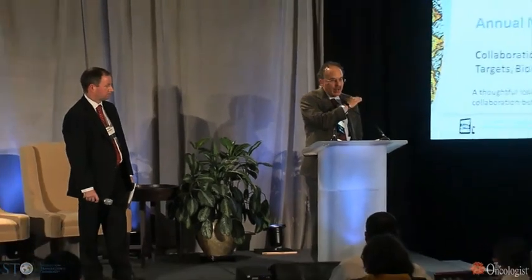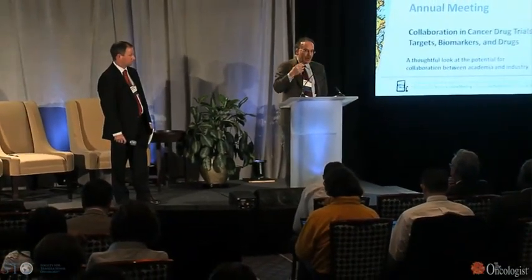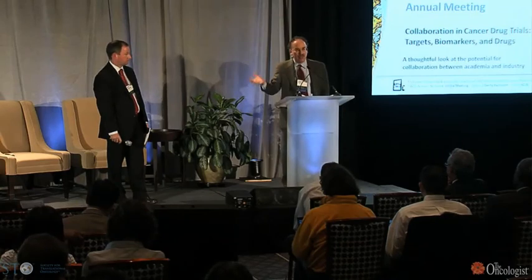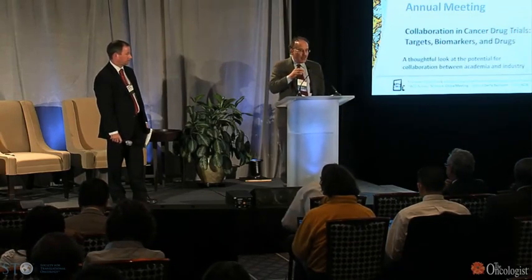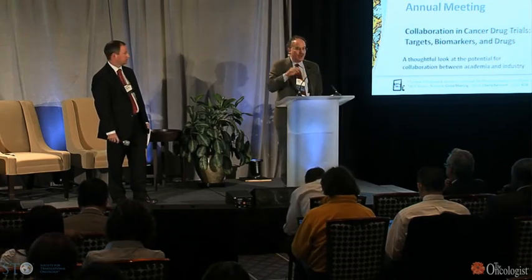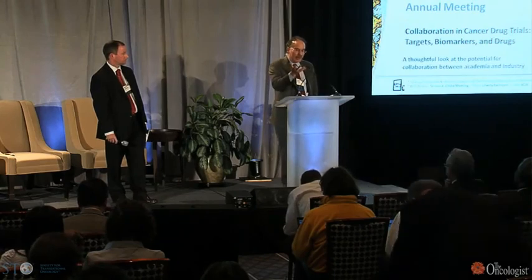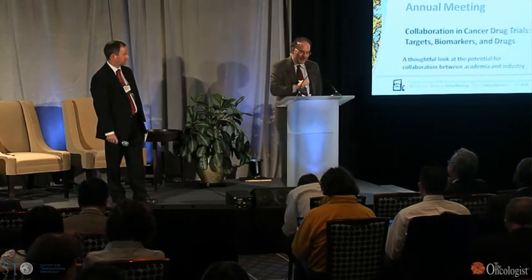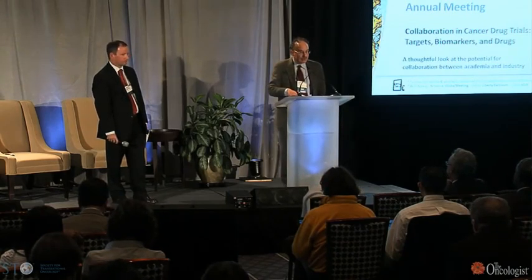I think that philosophically, the current technology, with the Veridex platform, is not that sensitive, so there's been appeal to having one antibody to capture everything and one antibody to stain everything. As the technology gets better and better, there will be enough markers to make a prostate chip, a breast chip, or 17 different chips. You know, if Jose would like 25 different breast cancer chips, we'll make him 25 different chips. So I think if the technology works, then we'll be able to justify specific antibodies for specific questions.